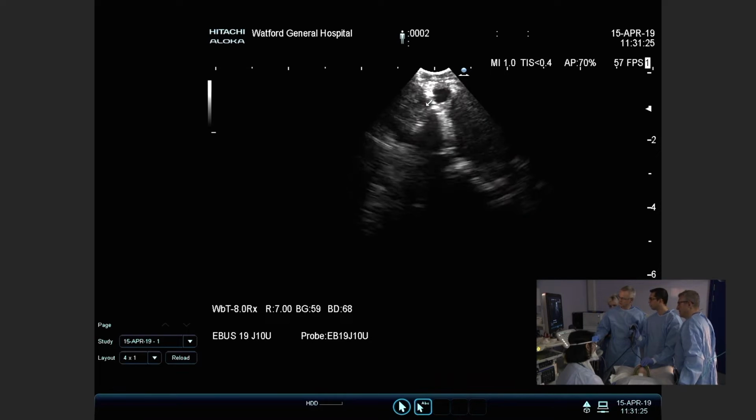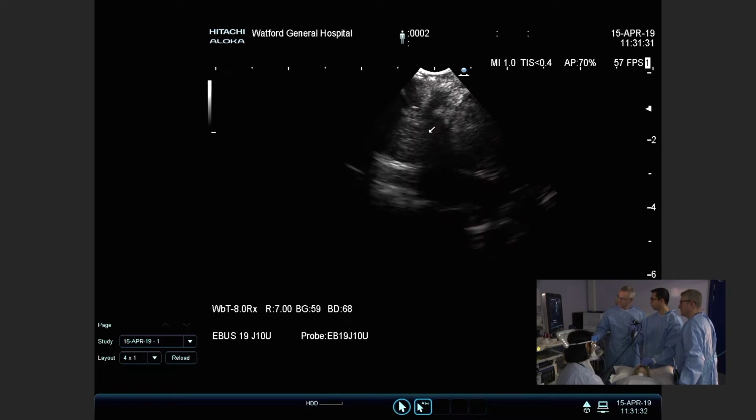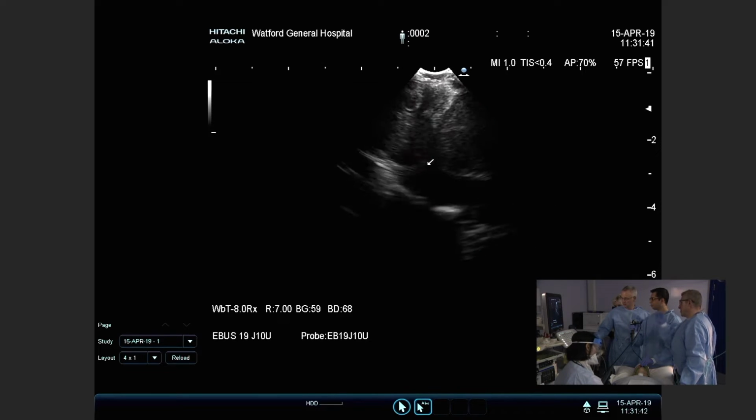Yeah, go up, that's the one. And then it follows down. Track it down. It's squashed in there between 2 nodes. Very nicely shown there. So we're actually looking at the SVC being compressed. Certainly a little bit, with this bulging. That is 10R.